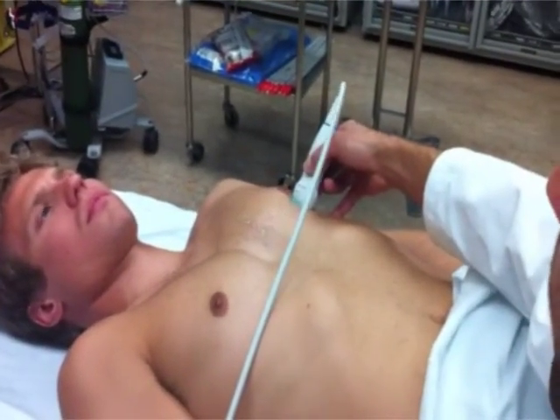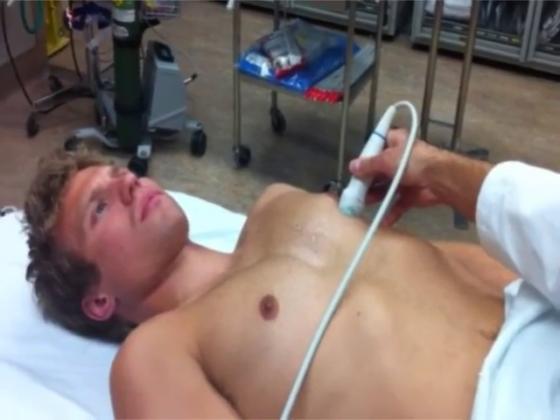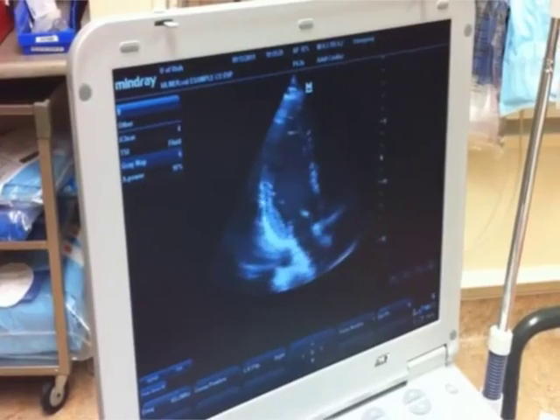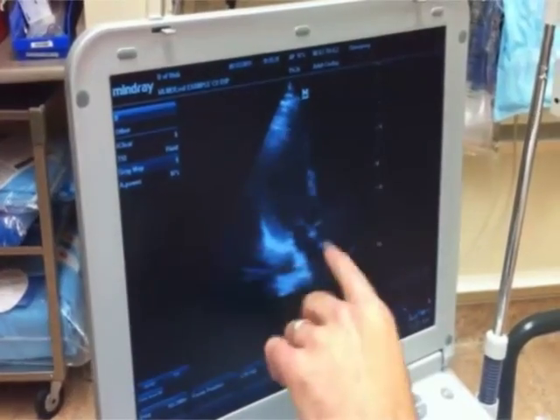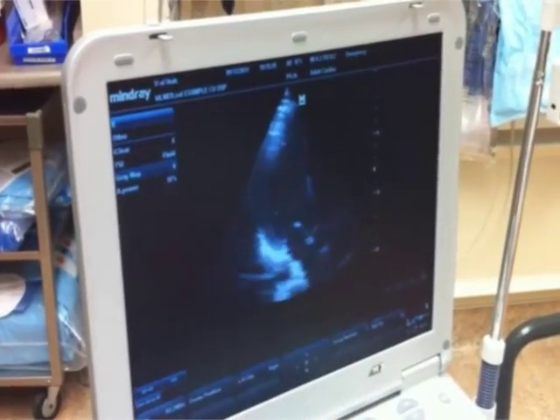Now, if you watch the probe, what I'm going to do is basically rotate the probe about 90 degrees so that it's now pointing back towards his right shoulder. When I do that, if you look again at the screen, you'll see what's called the apical long axis. That's basically the same view as we had a minute ago when we were measuring the LVOT, but now we're looking at it from the apex.